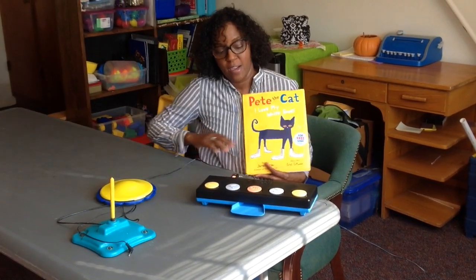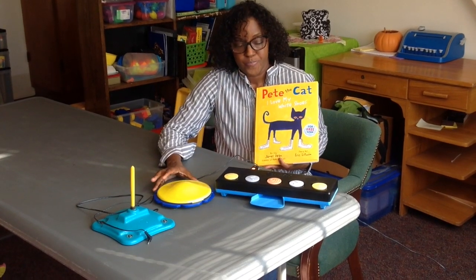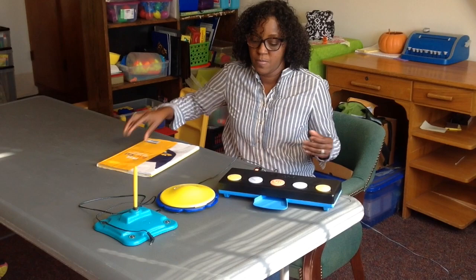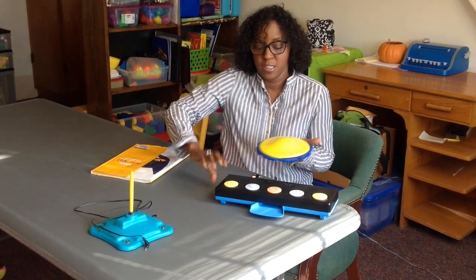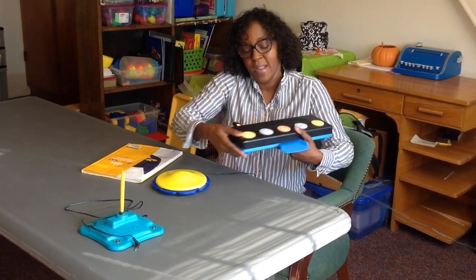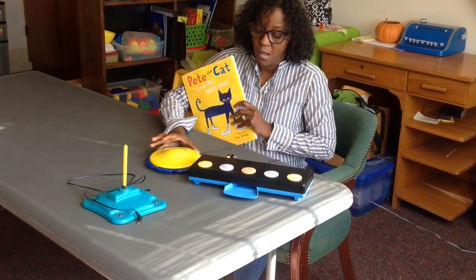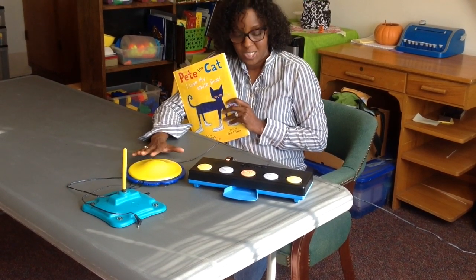Using the Joy Player for simple cause and effect. With my guys, I stick my button. I use the dome button because it has more range for my kids that have limited range, and I just do the play, and so they're able to turn a song or a story on with just a touch and stop it with just a touch.